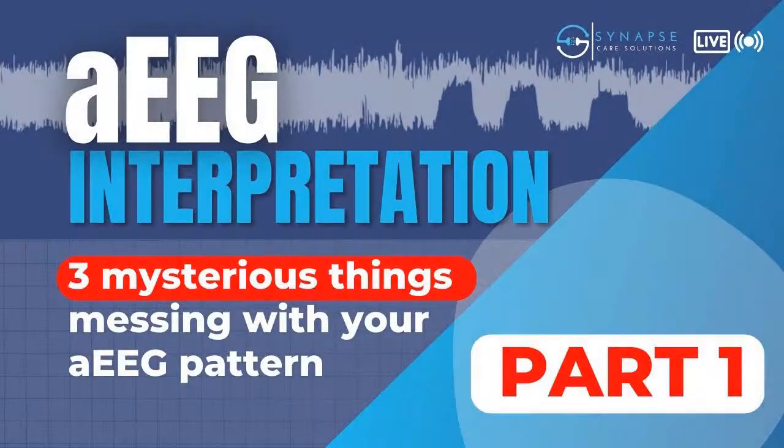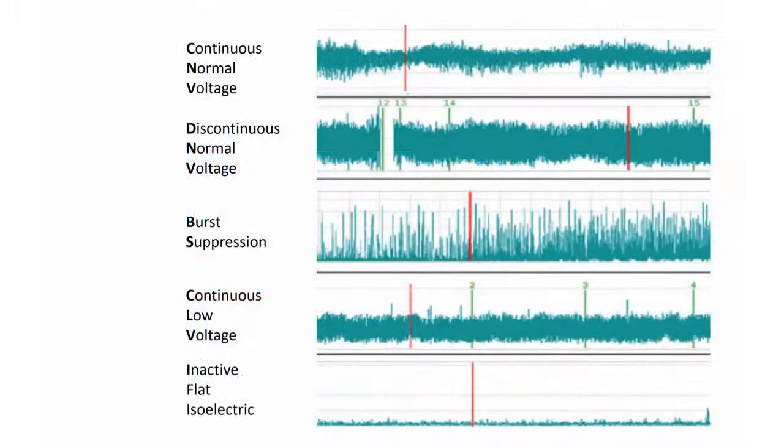So today's topic, I wanted to just do a quick refresher on our 5 basic patterns of aEEG, because I feel like we need to know this in order to understand how medications affect this. So for normal voltage, we always want the upper margin to be greater than 10, and for the lower margin to be greater than 5.